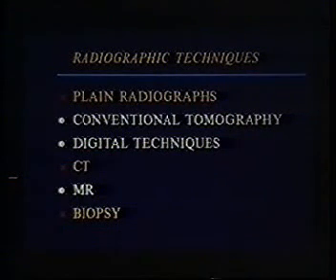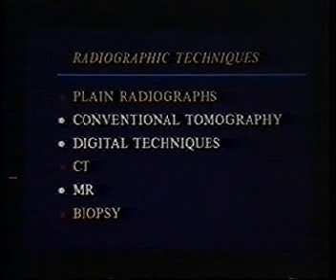Some other procedures that have been used or are being used, at least experimentally: conventional tomography, of course, has been used for years. I think in current practice it has been largely replaced by CT. Some digital techniques, dual energy digital techniques and digital analysis of regular radiographs, have been used in some institutions for the diagnosis of solitary nodules and may be of some value. And MR has been evaluated, at least experimentally, but with its current state of development does not have a great deal to offer, I don't think.